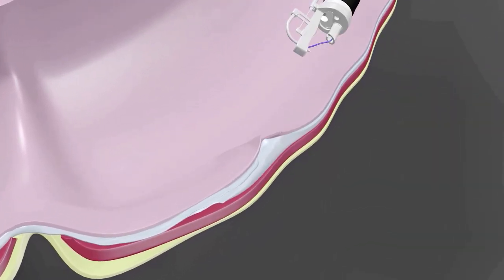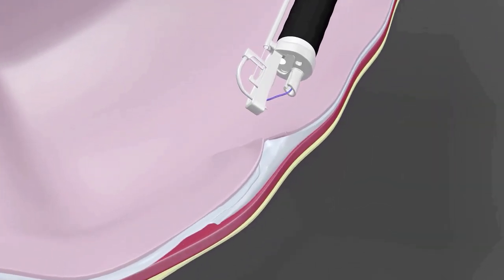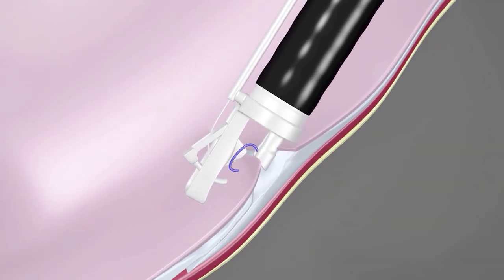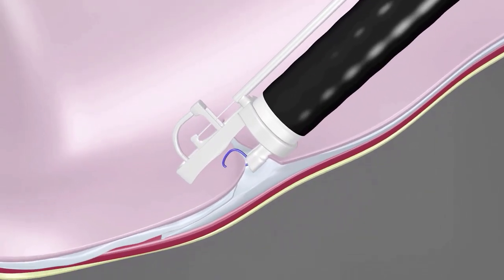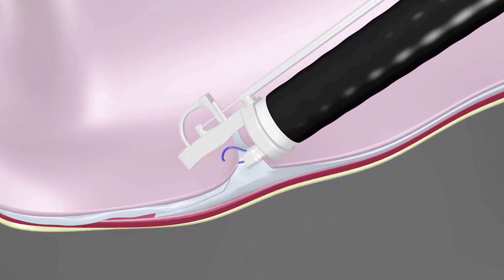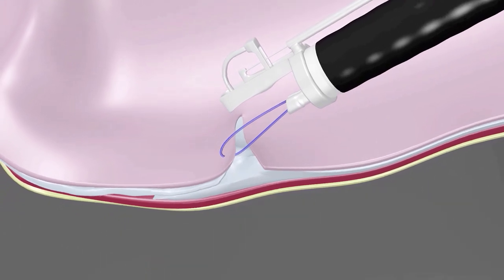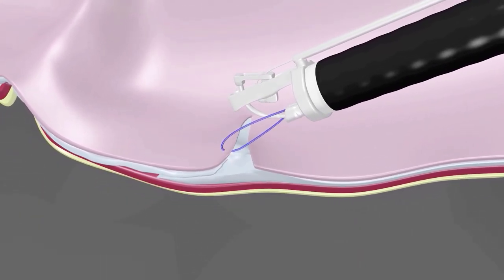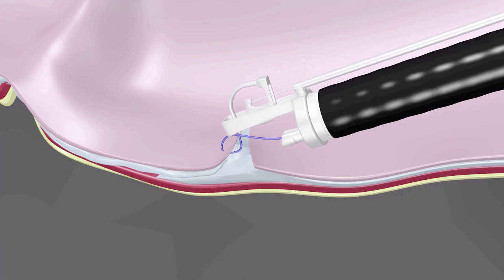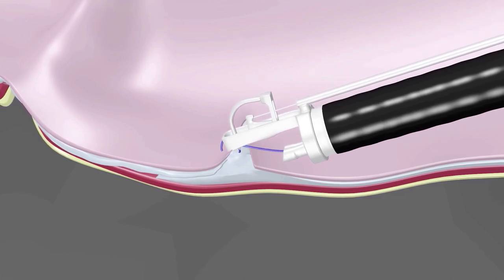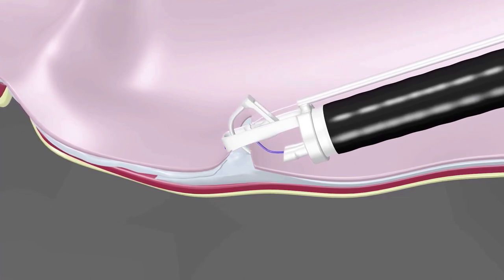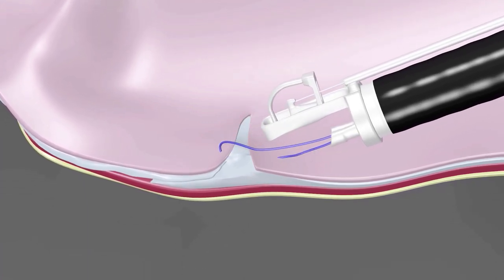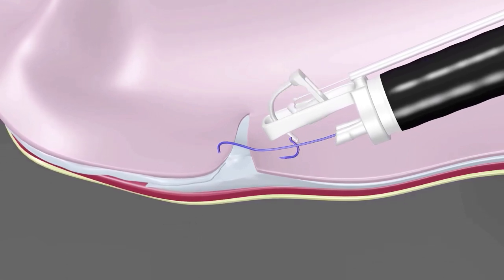The last step is closure of the defect. In this case, we use an endoscopic suturing device. We perform a running full-thickness suturing pattern, starting the suture from the distal part of the defect, then alternating stitches from the proximal and distal parts of the defect.